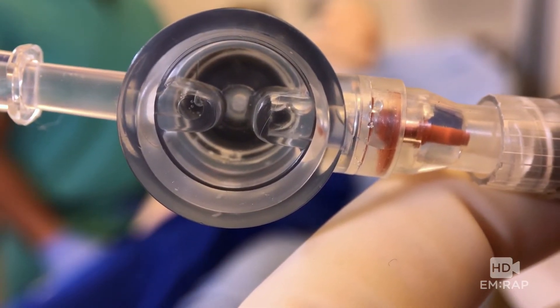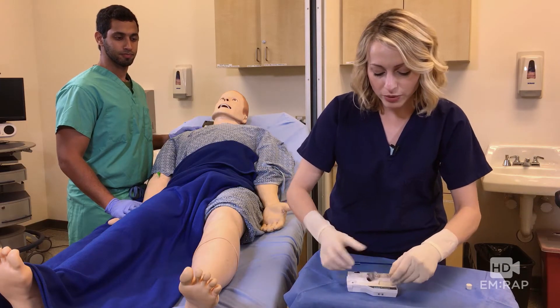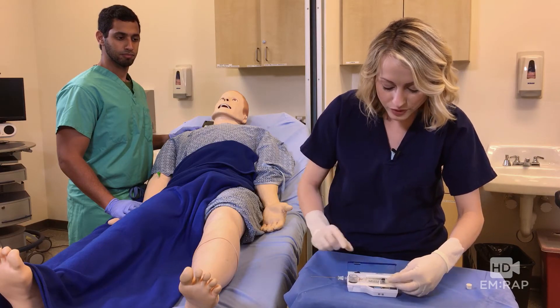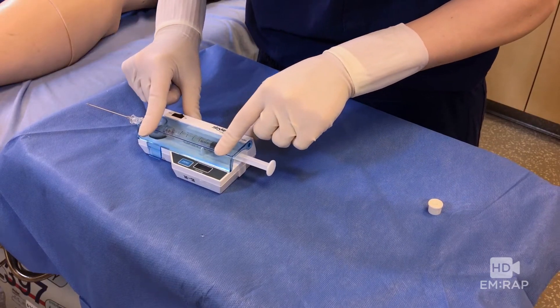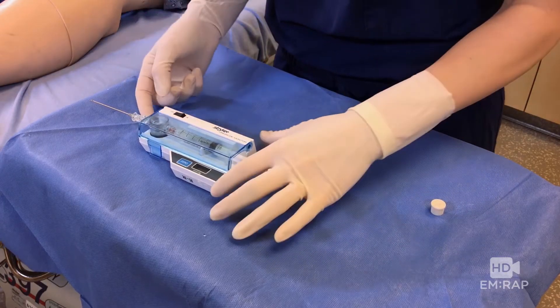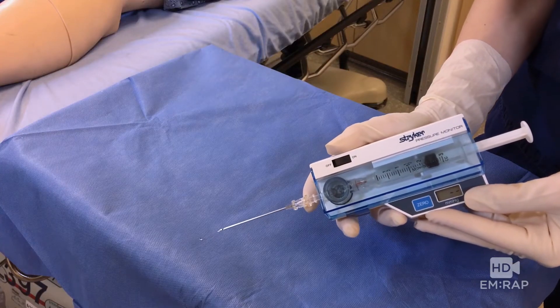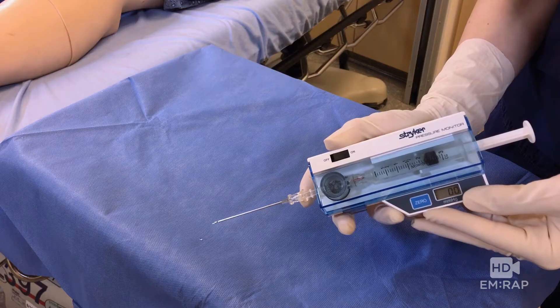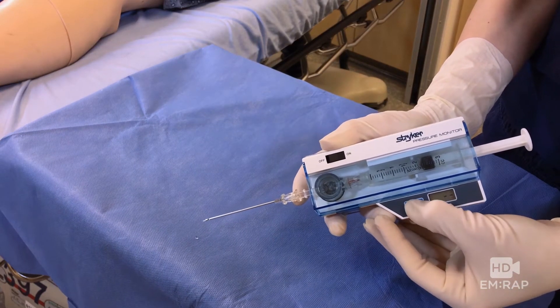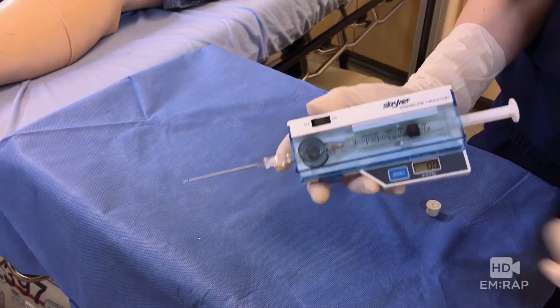Easy peasy. Looks good. Now we're going to load this into our pressure monitor — open this chamber up and it should snap right in place. The drawer should close nice and easily. If it doesn't, then you need to readjust the angle of the flange of your syringe. Let's turn it on. And to zero it, you're going to hold it at the angle that you're going to use to insert it into the patient, and you're going to hit the button conveniently labeled zero. You should get zero on the screen. Now we're ready to check our compartment pressure.